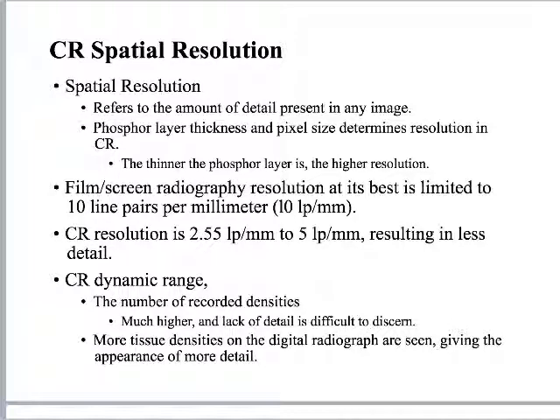But just to bring it back home to some stuff that we've already talked about. When we talk about CR and we talk about spatial resolution, since this is a fairly lengthy process, like it involves this PSP plate, it's got to be a red laser, blue light.